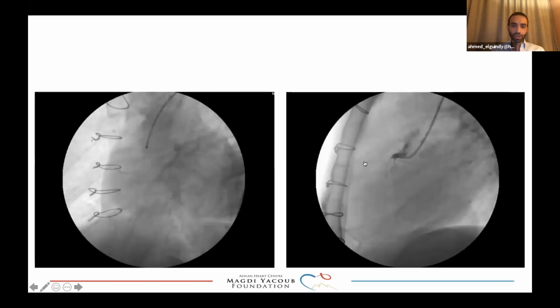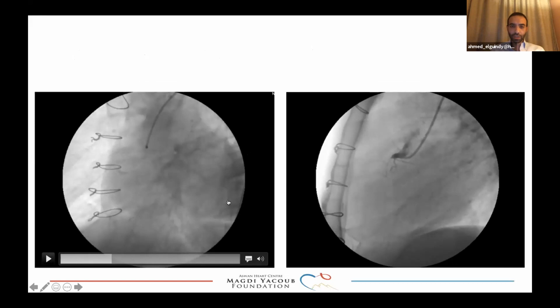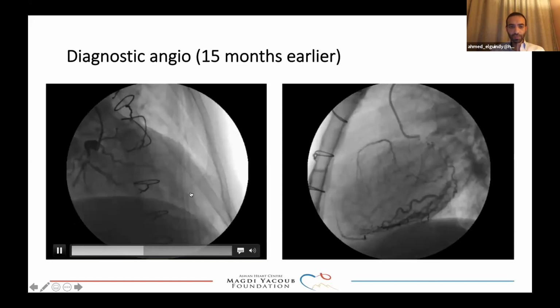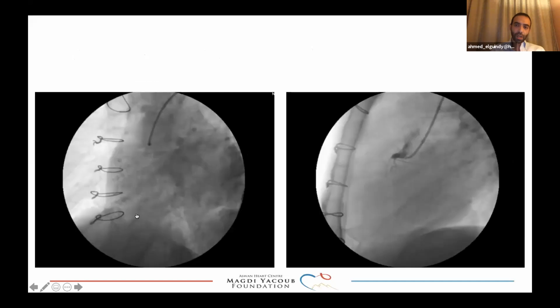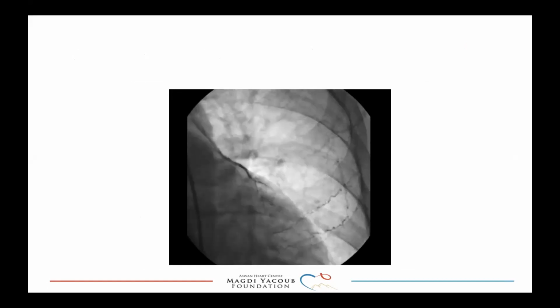On the right coronary artery, there is a totally occluded vessel, and we can't really see any flow antegradely, but we can appreciate from the previous slide that the RCA fills retrogradely via septal branches from the LAD essentially. And you can see the RCA here. Totally occluded LIMA, so that was similar to what the CT told us.